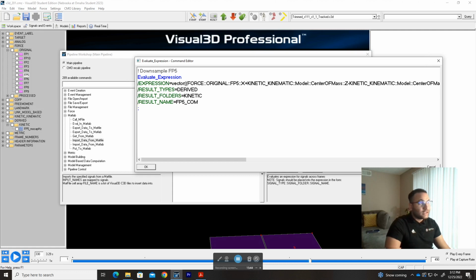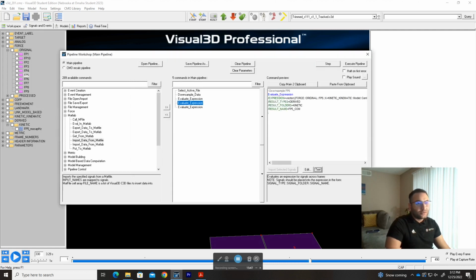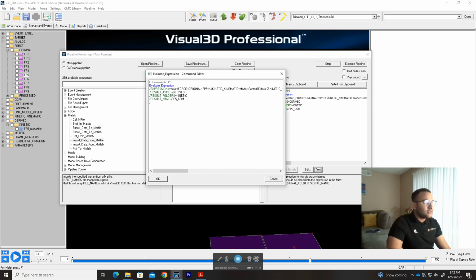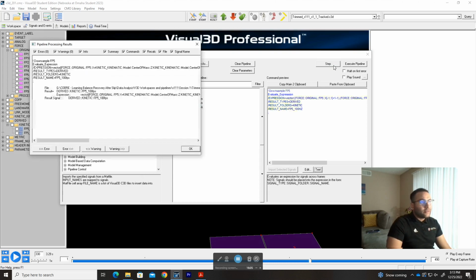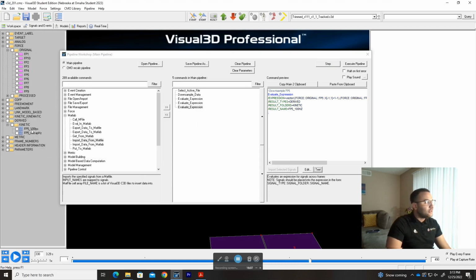It doesn't really matter what I call it, it's going to give you the same. So let me change this name to mocap. I'm just going to add frames per second like this, 100 frames per second. So I'm going to run this, and then we'll see the difference.